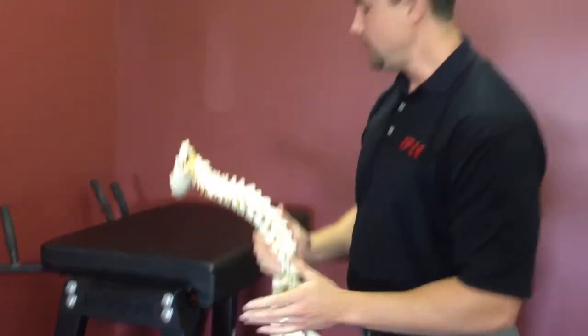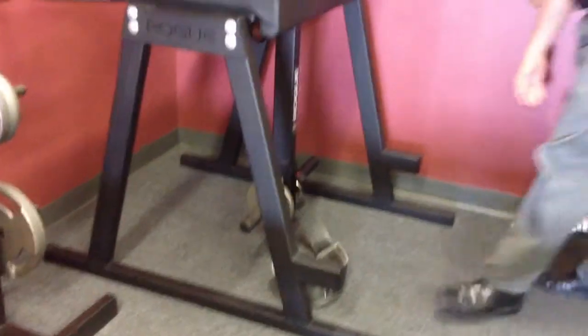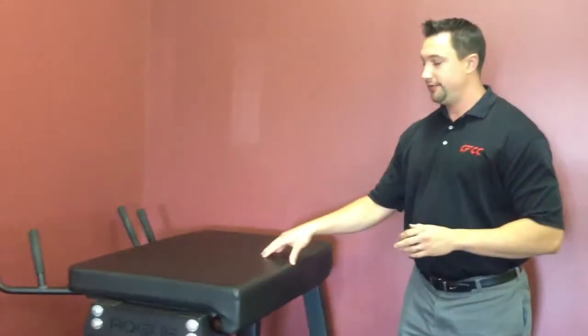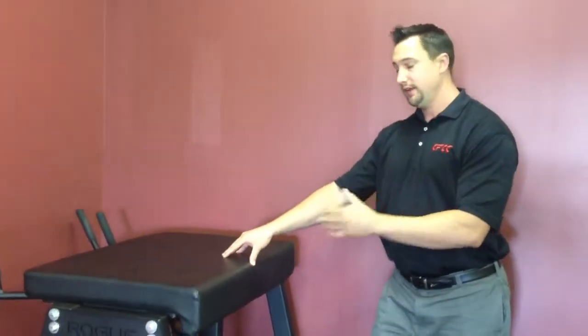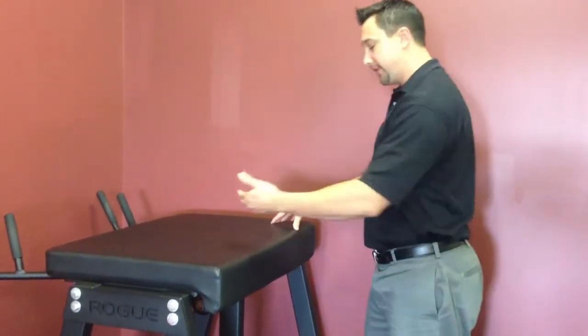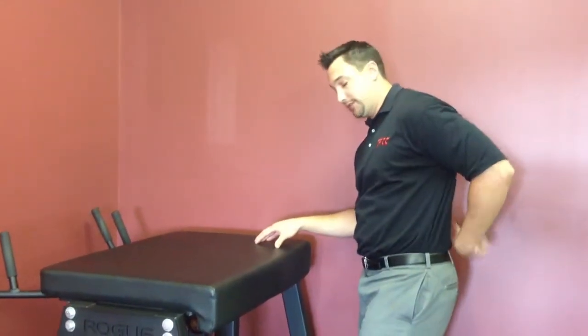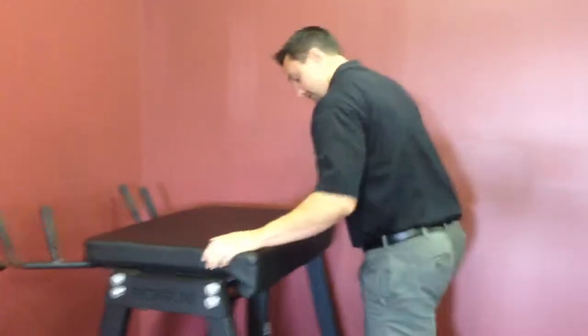So in the office, we like to use the reverse hyper here. We use it for a couple reasons. With the action itself, it promotes circulation to the disc, because when you lift the legs up, it compresses the spine, and you drop them down, the traction increases the fluid to it. But also the full range of motion really helps with the scar tissue formation in the lumbar spine. So we'll demonstrate here.